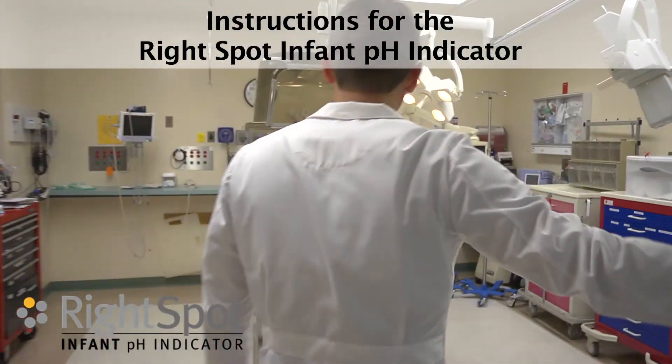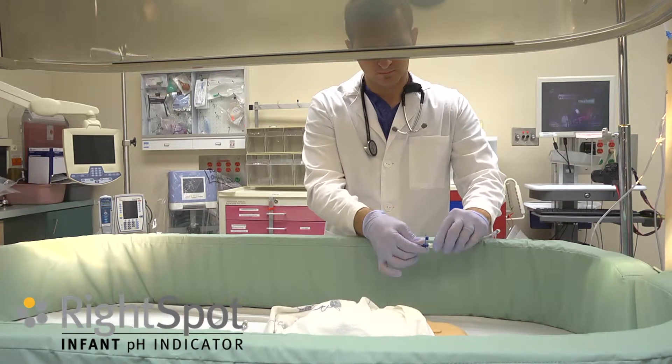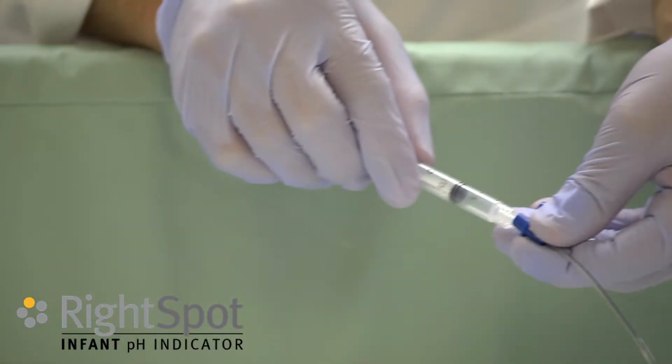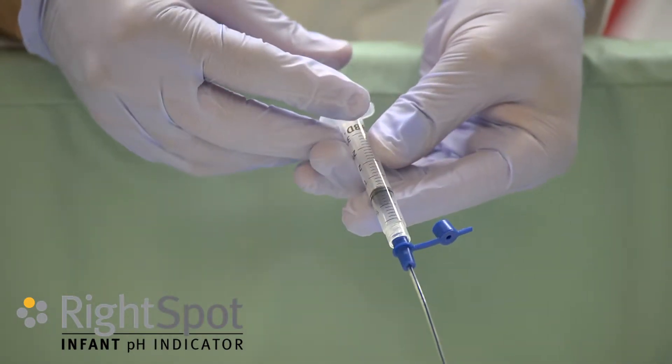These are instructions for the Right Spot Infant pH Indicator. Turn off feeding supplement if the infant is receiving feeding. Clear the NG tube with air. The amount of air used needs to be determined by the clinician.